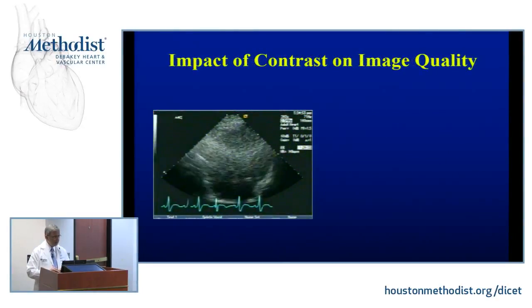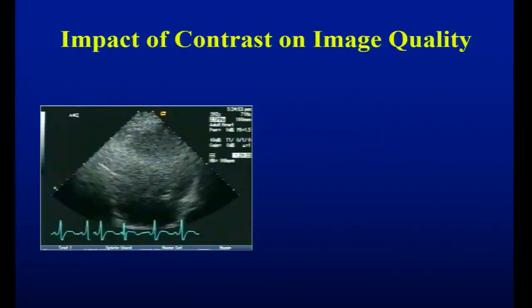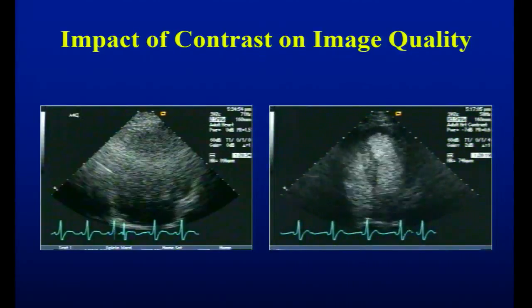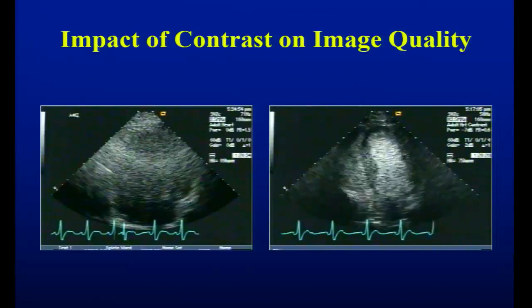Okay, well, this is a beautiful image, as you could see. Something that you'll be very proud of now. And basically to illustrate the power of such a technology, right? You can't see a thing. And by injecting any of these newer agents that have been approved for several years now, you can see the heart very nicely.